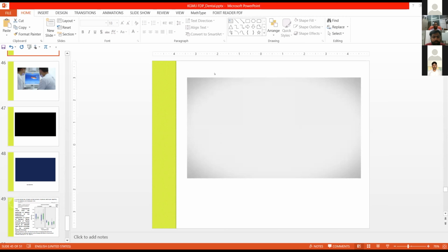Then a lab scanner or an intraoral scanner, they both scan, but yes, we say intraoral scanners are more accurate as compared to the lab scanner, because with intraoral scanners you're scanning directly in the patient's mouth. Whatever the issues, problems, whatever the preparation you have done, we are able to scan it directly in the patient's mouth. Whereas for the lab scanner, we have to take the conventional impression with putty or alginate or whatever you prefer with the light body wash. But still there are errors.